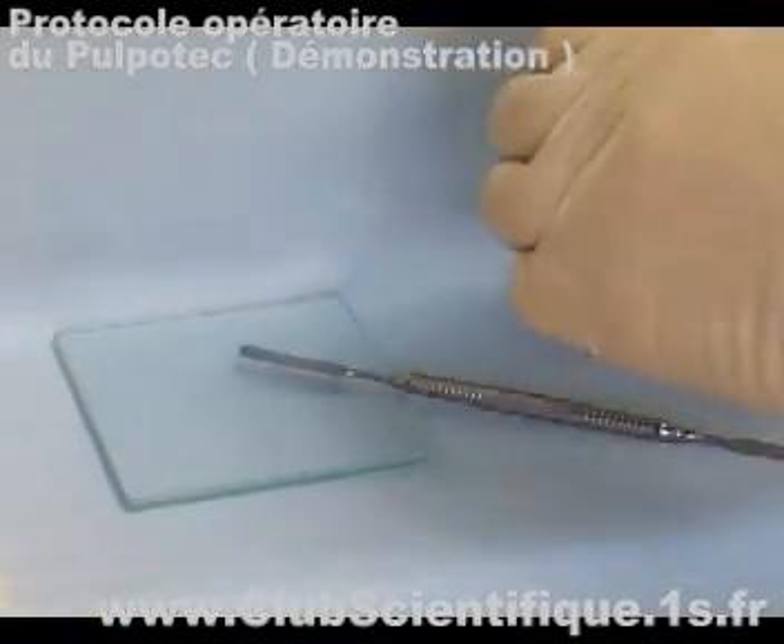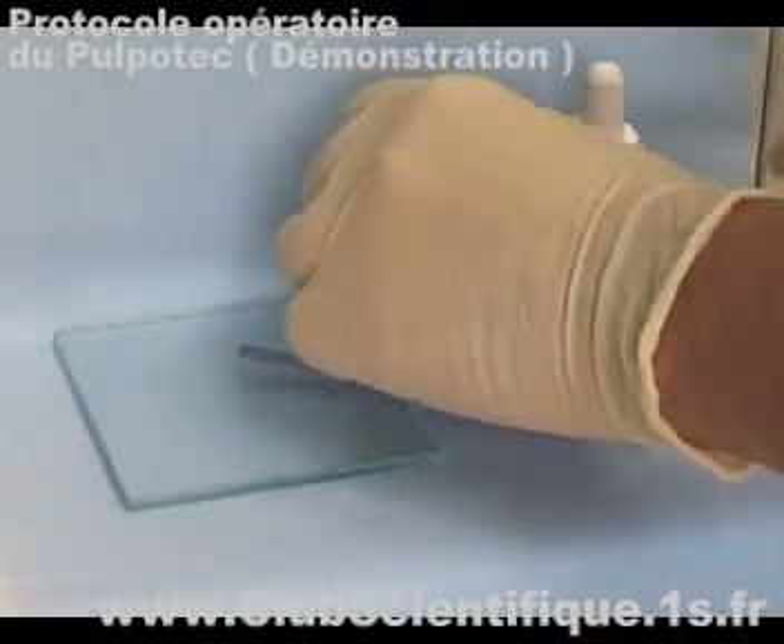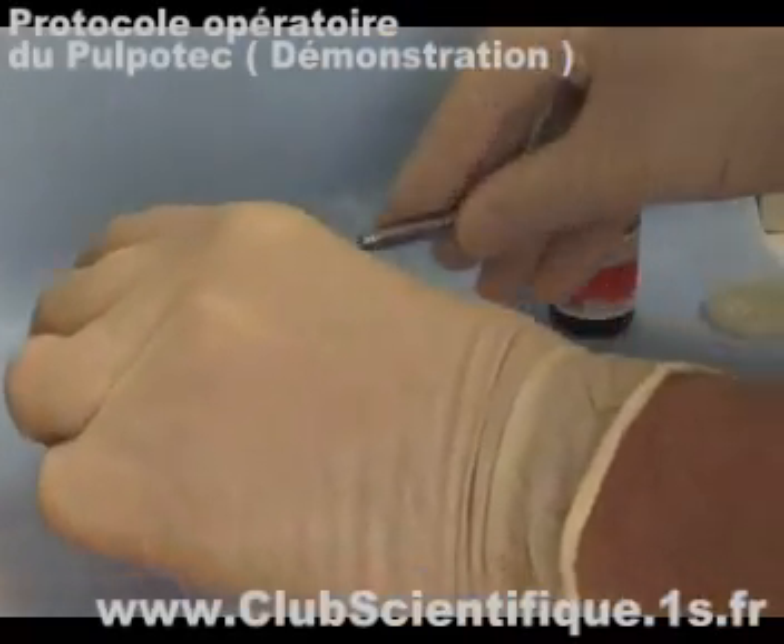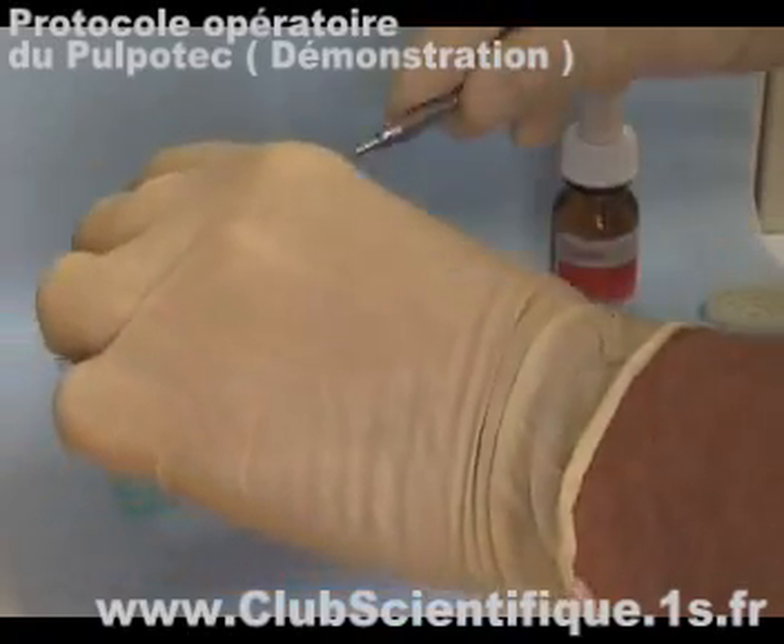To obtain the required thick and creamy consistency of the paste, the powder and the liquid of Pulpatec should be mixed on a glass slab.